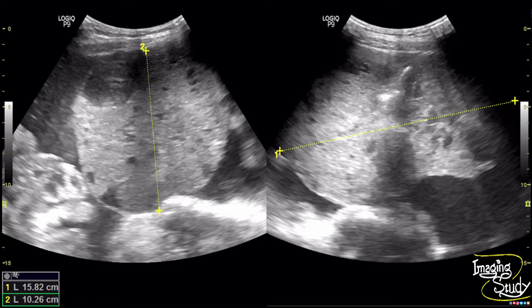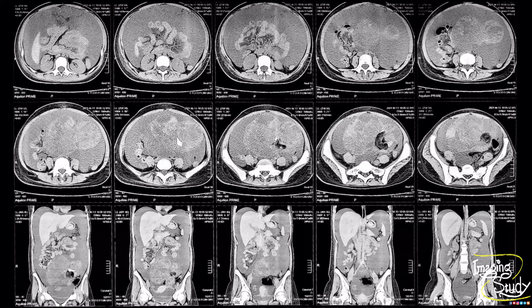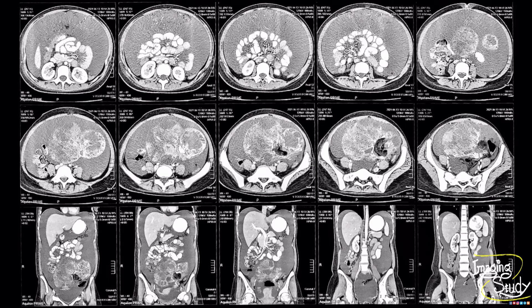Now let's see the CT scan findings — these pictures are collected from film, so image quality may not be optimal. On non-contrast CT, you can see a huge amount of peritoneal collection. There is an irregular multi-loculated mass with fat density and a calcified area, suggesting a dermoid. When contrast is applied, the arterial phase shows increased uptake within the lesion, which highly suggests malignant transformation of the dermoid. Malignant transformation of a dermoid is quite rare, and here is the case.